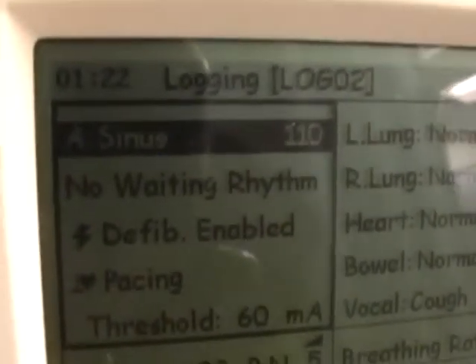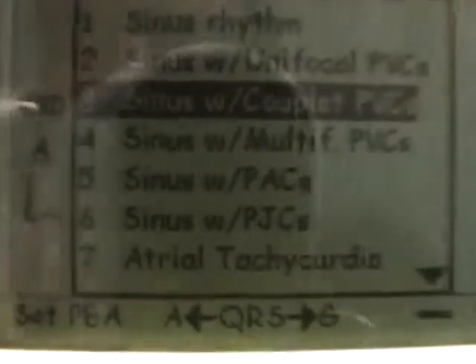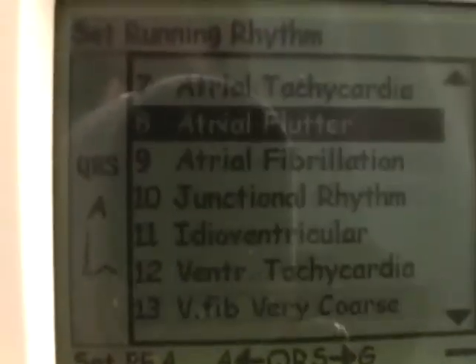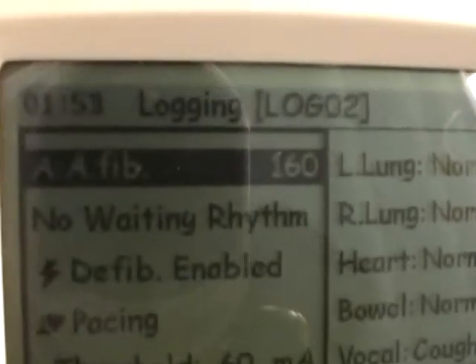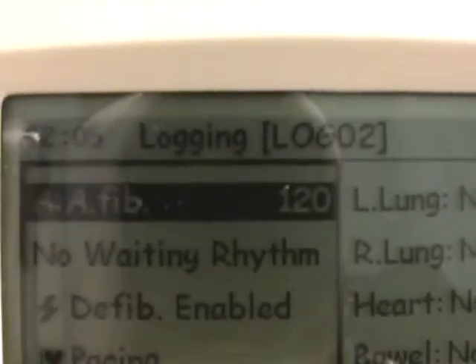Sinus — it's a regular rhythm. Let's say you want to teach your students atrial fib. While you've got sinus highlighted, press OK and find what you want. Scroll down until you go to the next page. There it is — atrial fibrillation. Press OK. We now have AFib at 160. That's its default. But say that's too fast — use your minus sign. You now have AFib at 120.